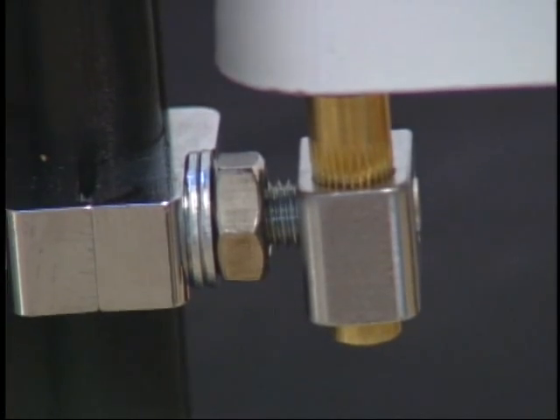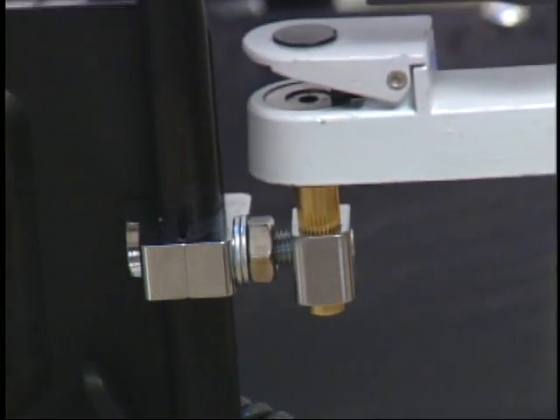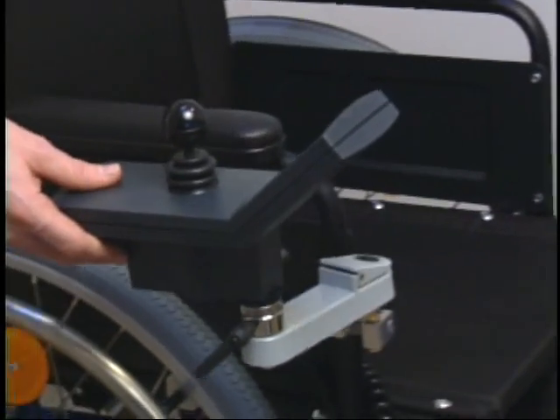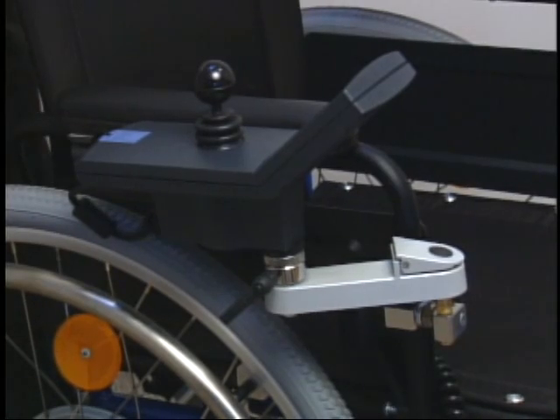A universal clamp attaches the joystick to the armrest or wheelchair frame. The optional swing-away arm enables the user to drive up close to a table or desk.